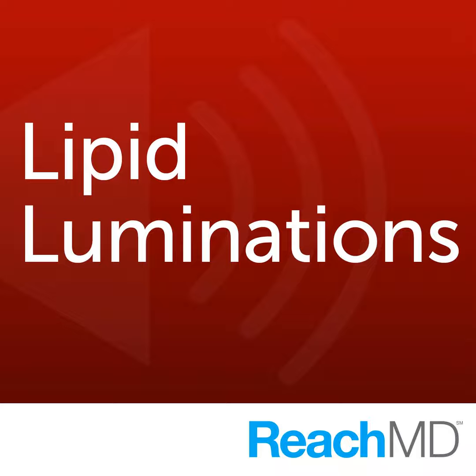So first of all, to reiterate, for the appropriateness criteria for the low-risk patient, they're low risk. Keep them low risk. You don't need to do expensive tests. For the high-risk patient, in general, the same kind of concepts apply. But for the intermediate risk patient, I think that carotid IMT is a great test to look at. I think also that coronary calcium score is a great test to look at. Which one is better? The data shows that coronary calcium correlates better in terms of your hazard ratio. There's no doubt about that. But at the same time, carotid IMT is also a very good test.